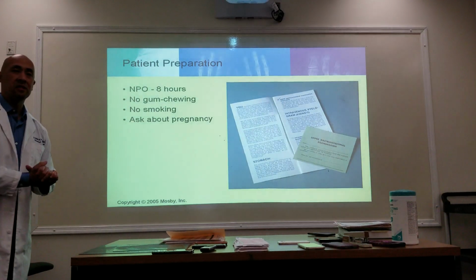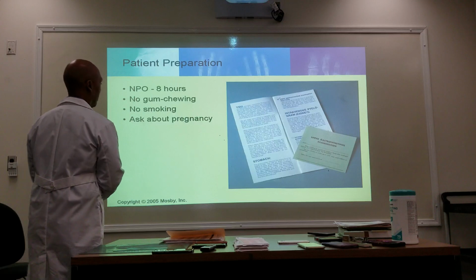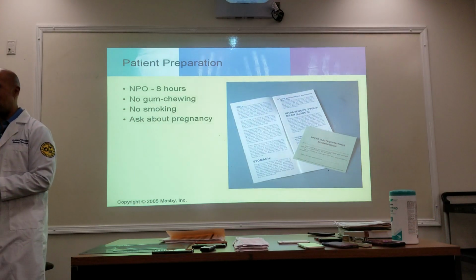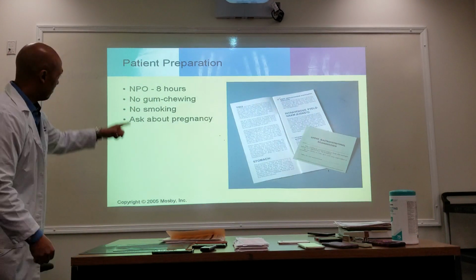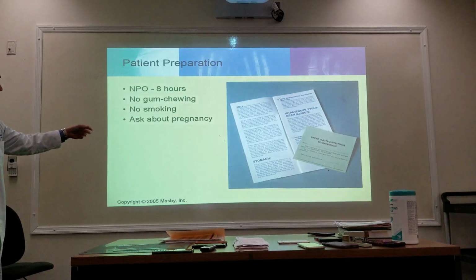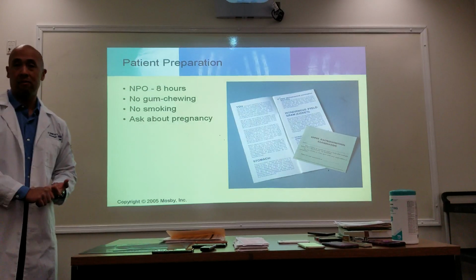All right, any questions? So let's go ahead and start talking about the position for the small bowel. First of all, patient preparation. If this is accompanied with an upper GI, same concept applies. They're NPO, 8 hours before, no gum chewing, no smoking, make sure they're not pregnant.